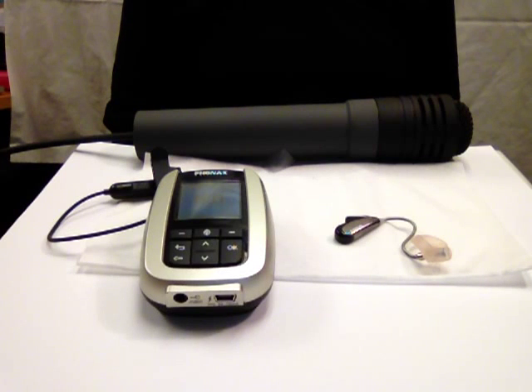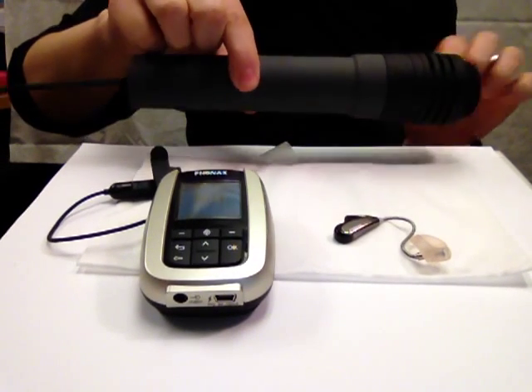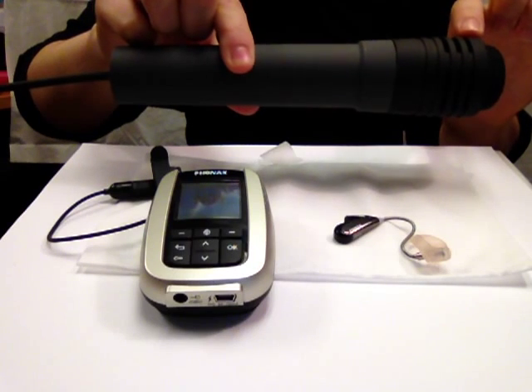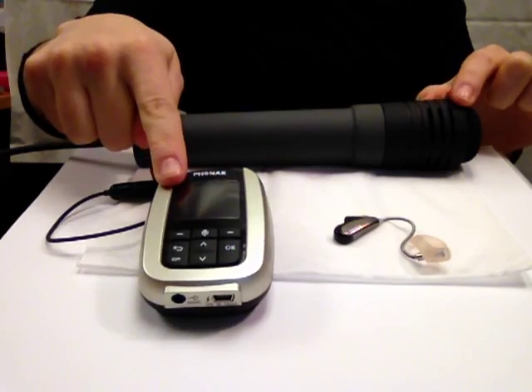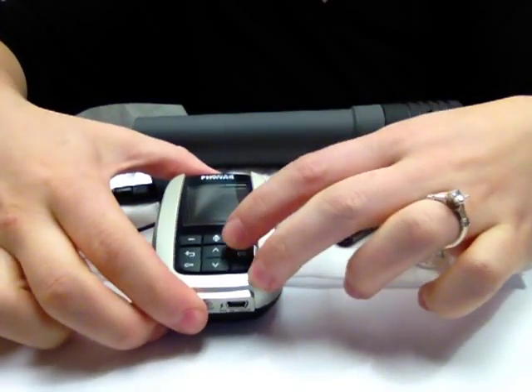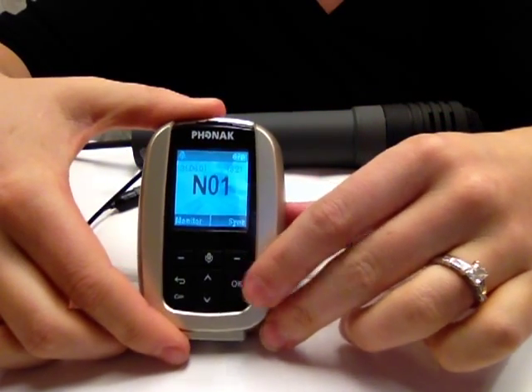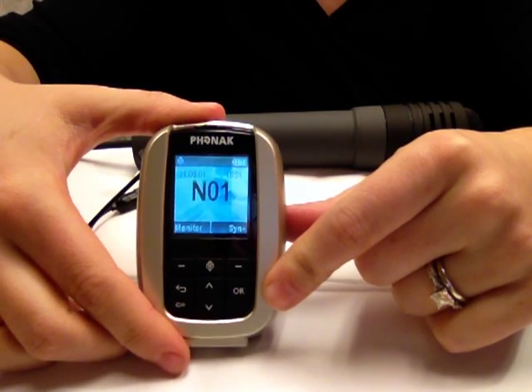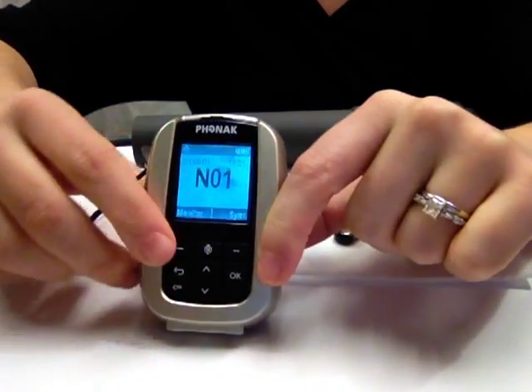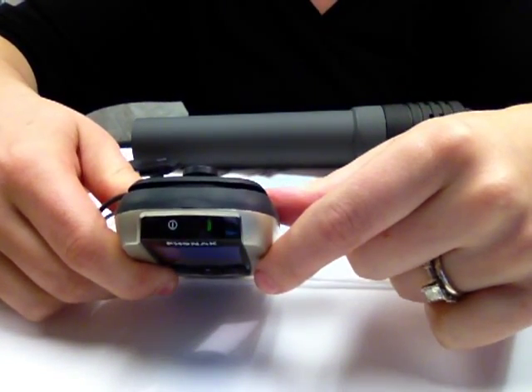The iSense Inspiro combination can also be used in conjunction with the DynaMic pass-around microphone. This is the DynaMic transmitter. It is important to know that the DynaMic is designed to use with the Inspiro on the multi-talker network. It does not function as a standalone transmitter. In order to activate the multi-talker network on the Inspiro transmitter, make sure both the DynaMic and the Inspiro are turned off. Turn on the Inspiro first by pushing the slider to the left.